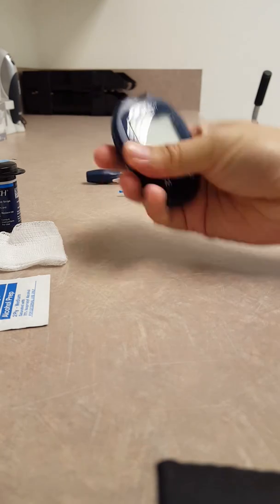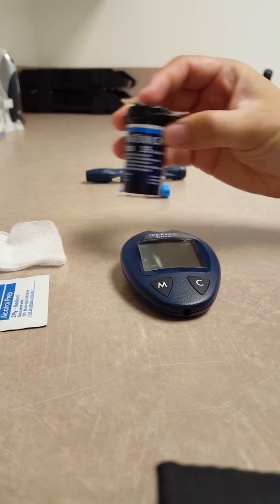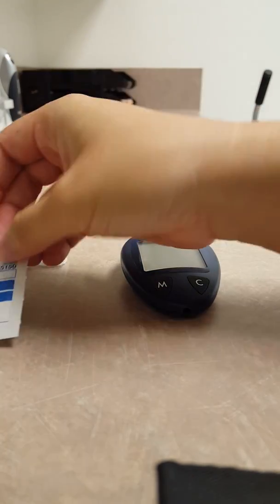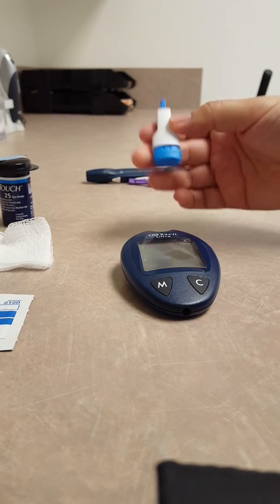So things that you'll need: your glucometer, your test strips, you will need an alcohol wipe, and maybe some gauze or a tissue.